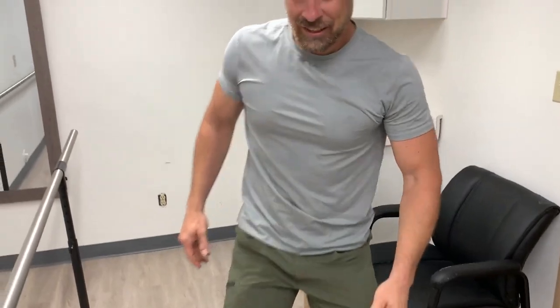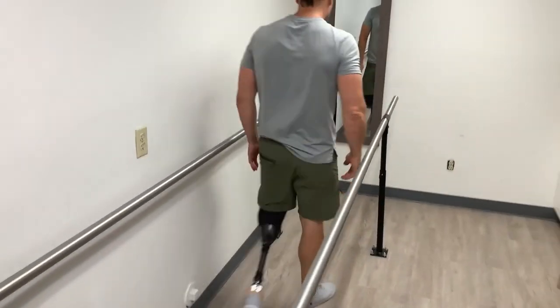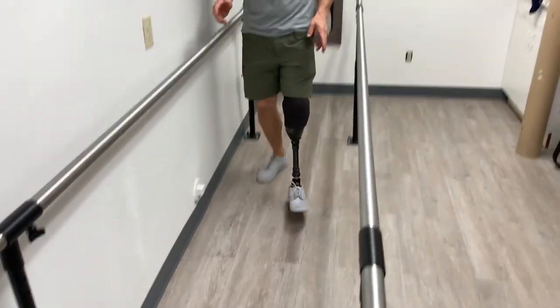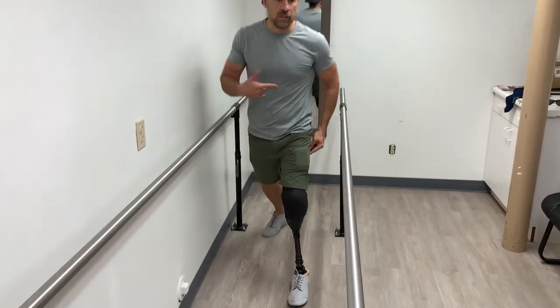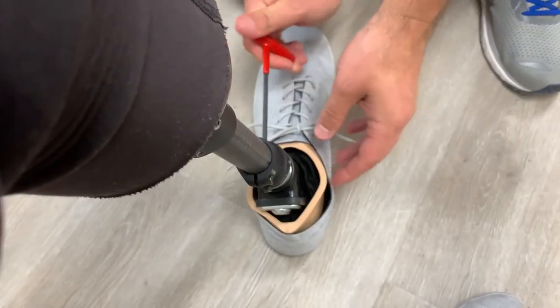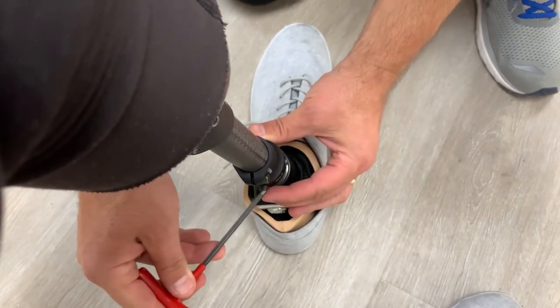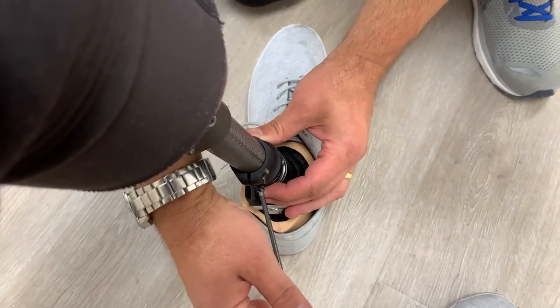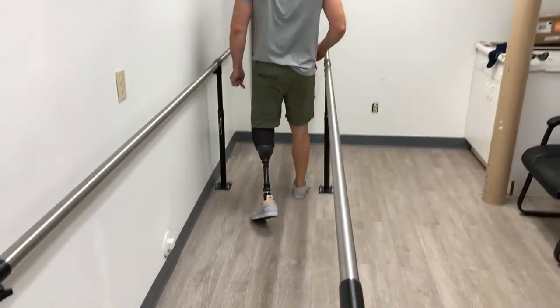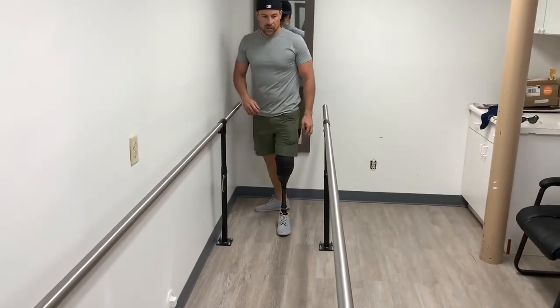Let's test this out. It feels pretty good. I can already tell I need more heel — can we do that real quick? We'll go a full turn there. That may be the exact opposite of what you actually... No, that's better. Looks better, yeah — that feels really nice, a lot better. Let's go outside and try it.